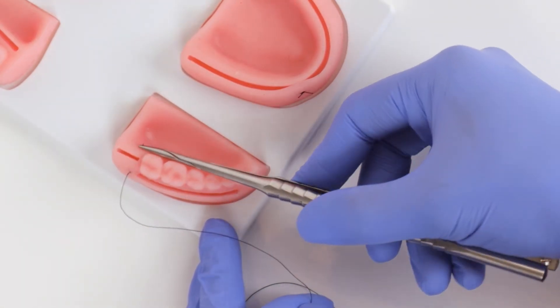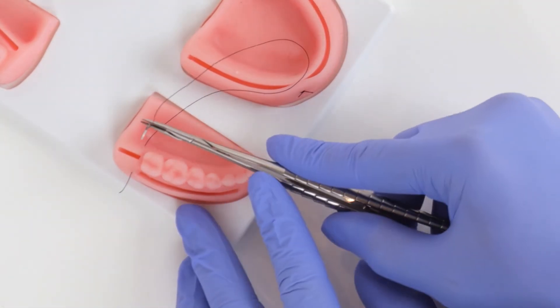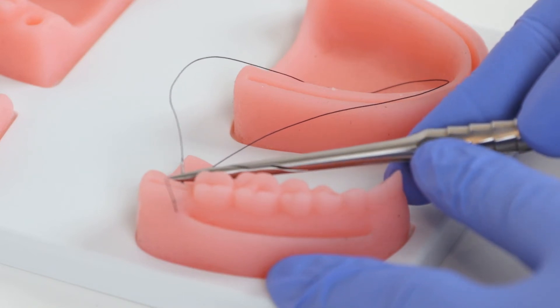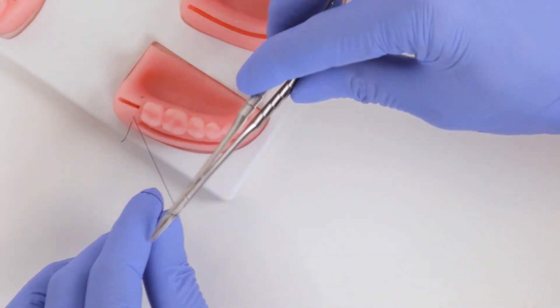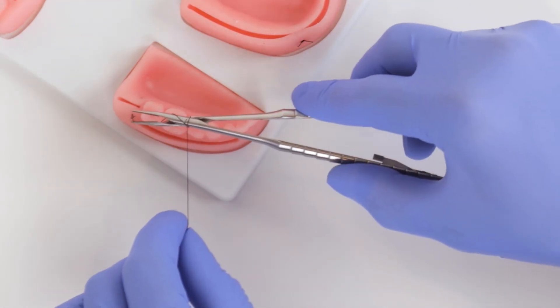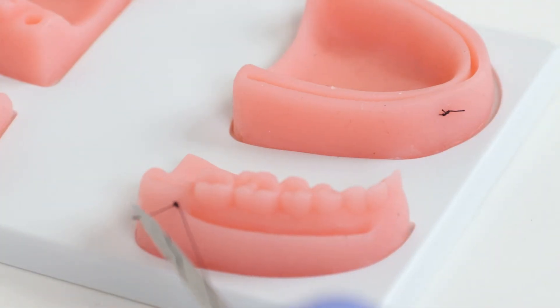And our more coronal pass through the tissues. Then we tie off. You can see they almost look the same, just because the knot is external and all these threads are internal, but it can make a difference. So it's good to know both techniques.